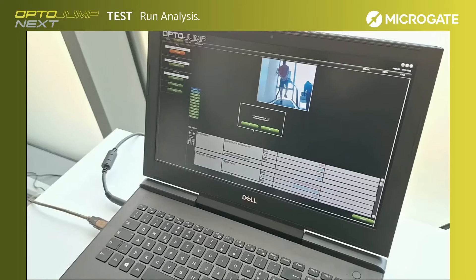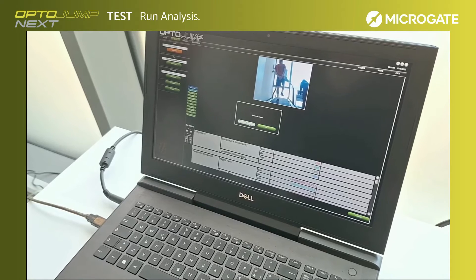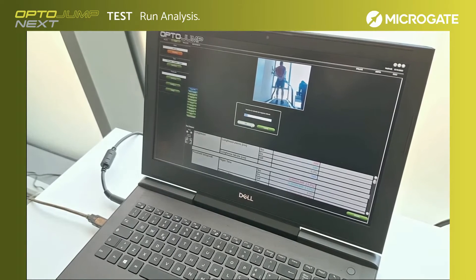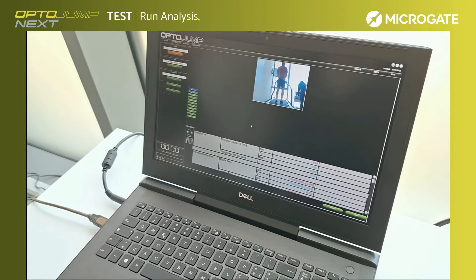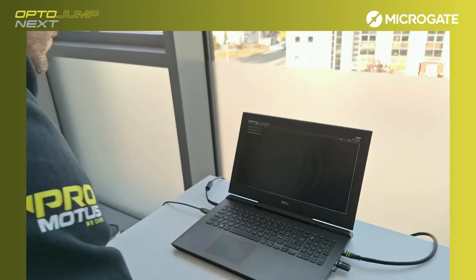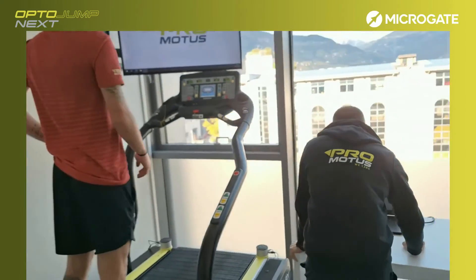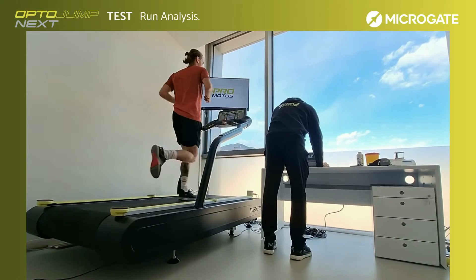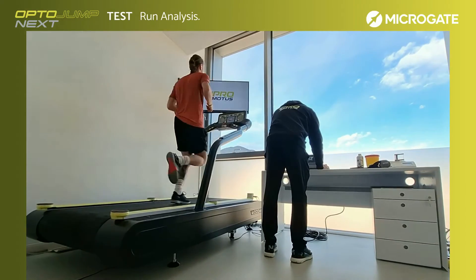Then select one or more athletes, the treadmill running test with specified speed, and press execute. If you enter a new athlete, you will be asked to measure the foot length for a better gait evaluation. We recommend starting the analysis only once the athlete is stable and comfortable with the preset speed. The evaluation should last at least two minutes.